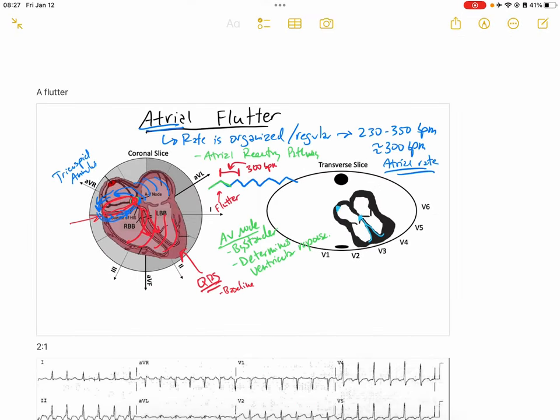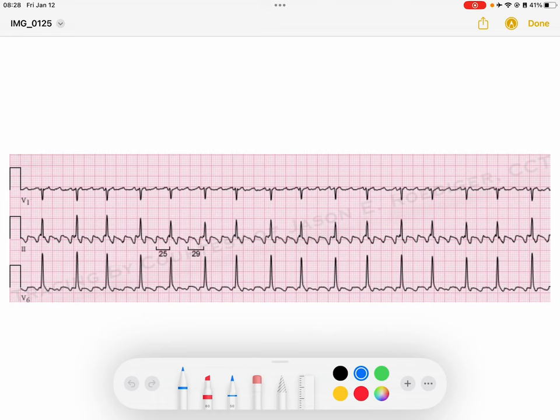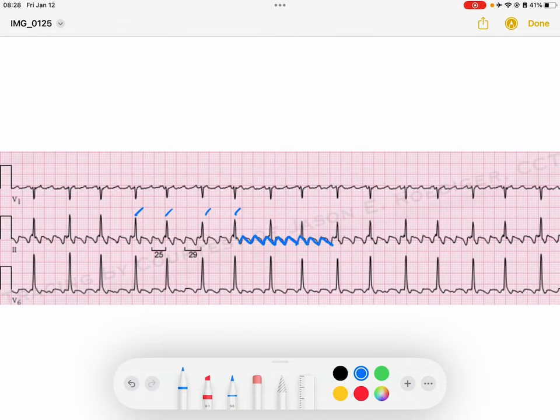Let's take a look at some EKG examples. This is a really clean example. What you'll notice is narrow QRS complexes occurring, and when I look at the atrial activity, I've got this sawtooth pattern. Notice whenever it passes through the QRS, it morphs into that QRS. The rate of these sawtooth flutter waves — each flutter wave is occurring at roughly 300 beats per minute in this case.